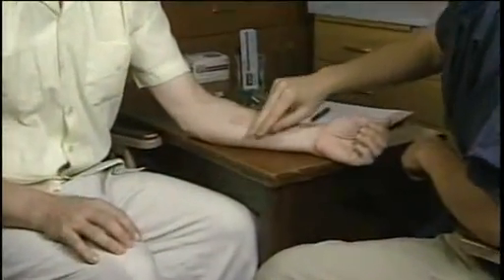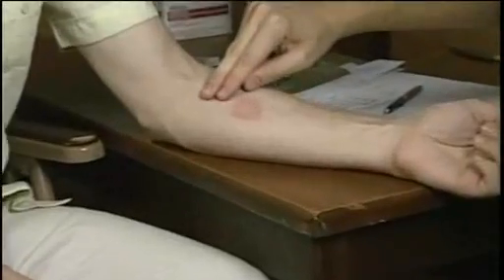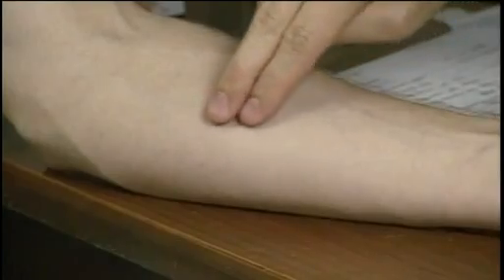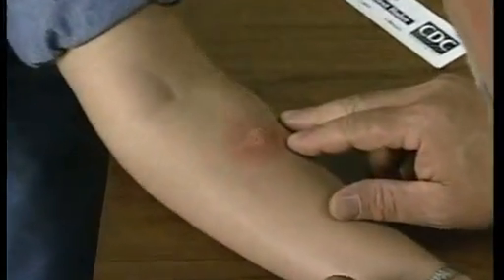Reactions to the skin test will vary. There is redness and swelling in this reaction, but there is no induration. This is a very large reaction with blistering, swelling, and redness. Make sure to record blistering even if no induration is present.